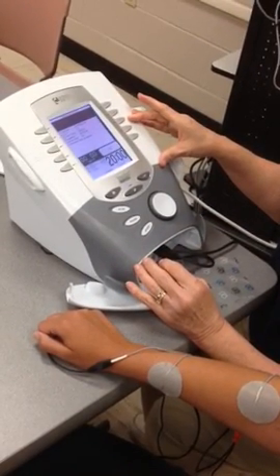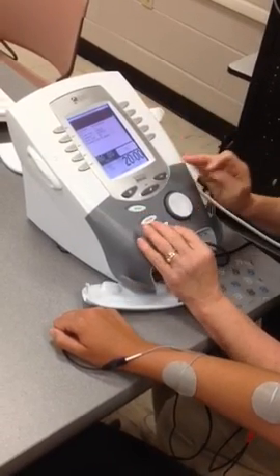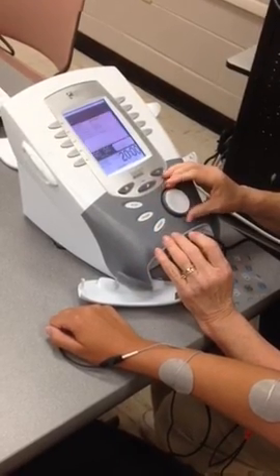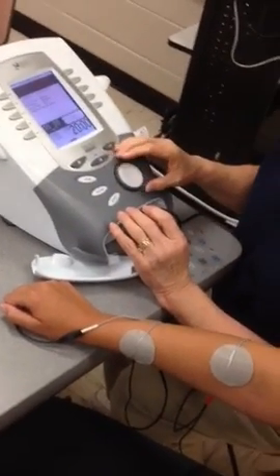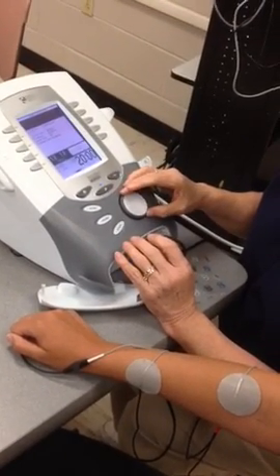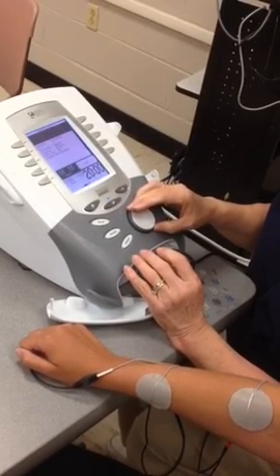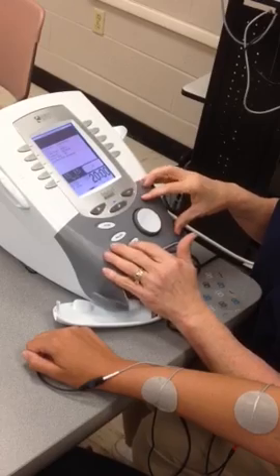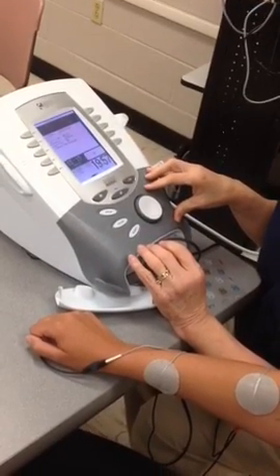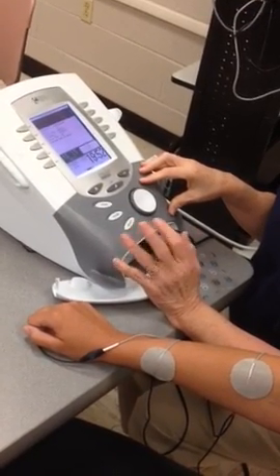So we are going to go ahead and start. All right, and you want to actually set the intensity before you start. So I'm going to try 1.5. You really want to get it to where you feel some tingling.